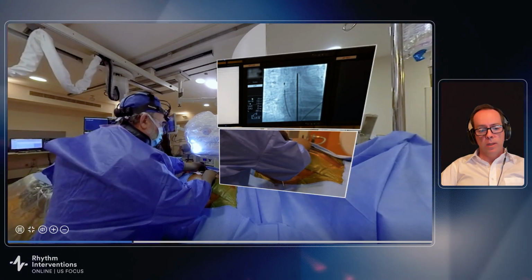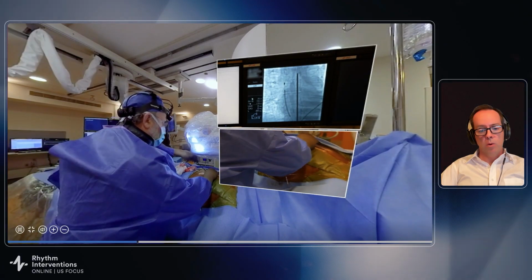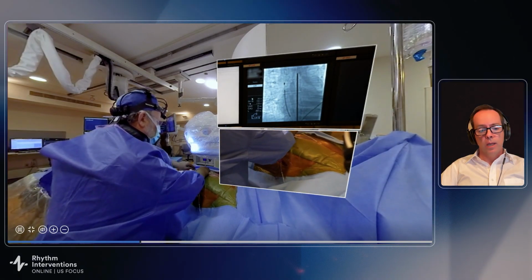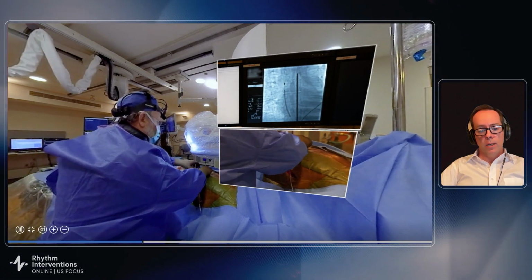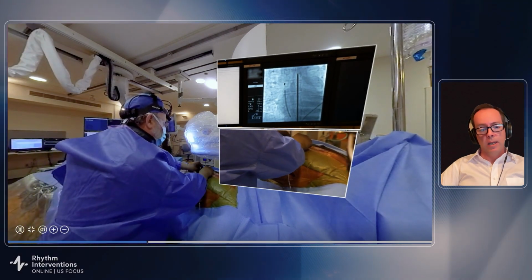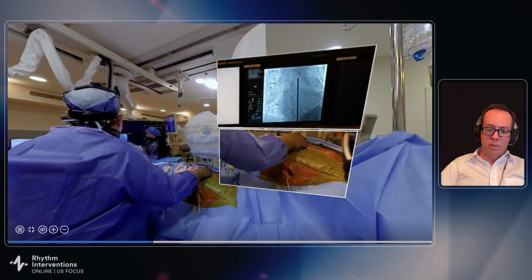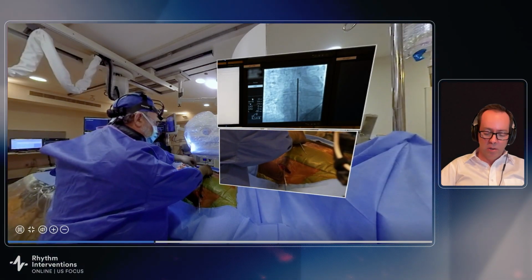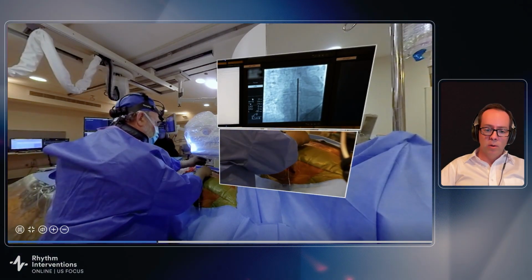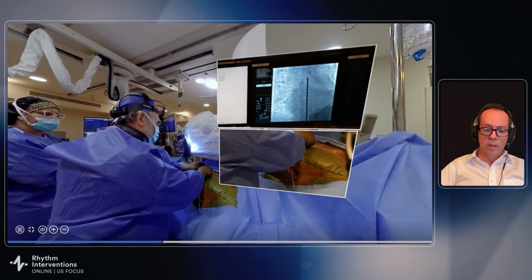Another difference between this implanter and what I've changed is I'm not wearing lead. I do not fluoro, and I do not fluoro because I mark up the patient. I consent the patient. When I consent him, I tell him, you're going to possibly have some markings on you. But I think as long as you have marked landmarks, this can be a fluoroless procedure.